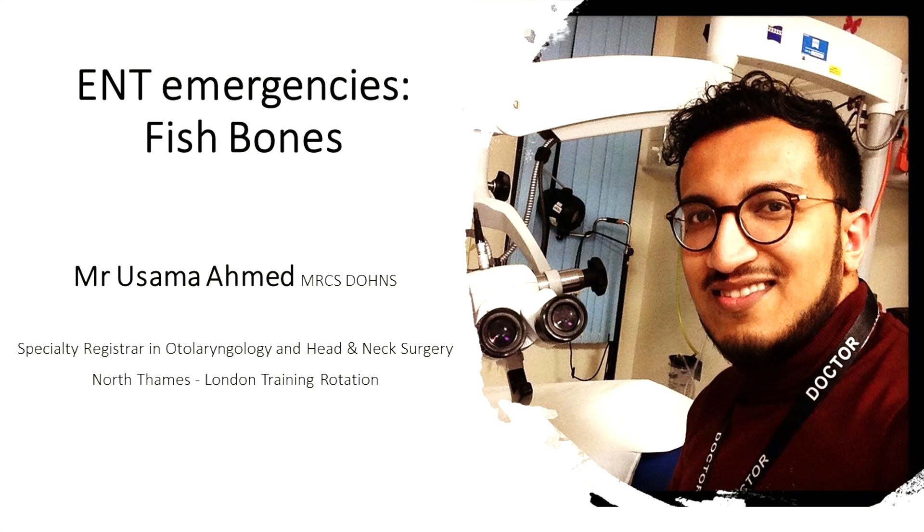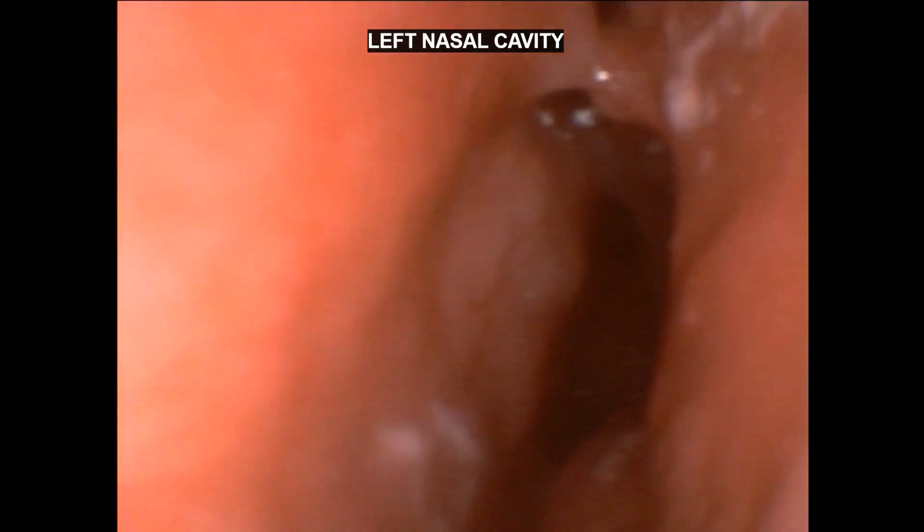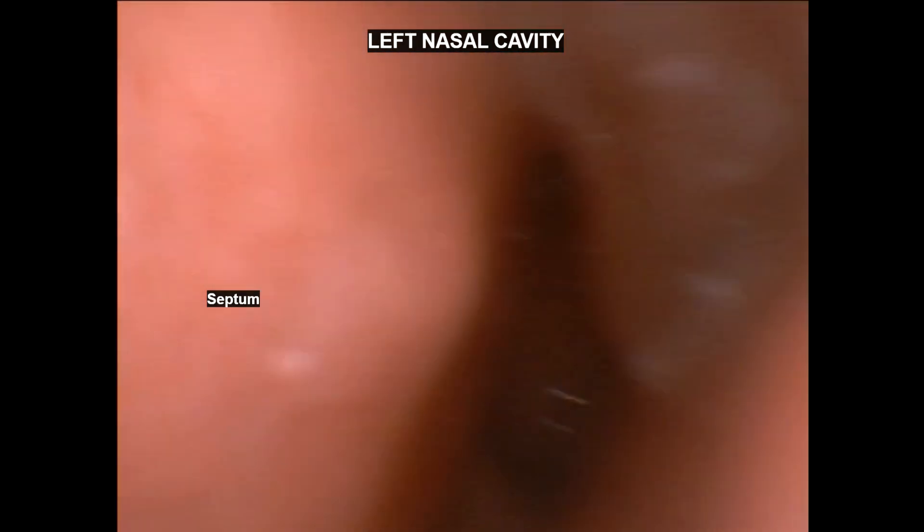Welcome back everyone, this is Osama Ahmed, ENT Head & Neck Surgery Registrar from London. Today I'm showing you how to take out a fishbone through the nose.